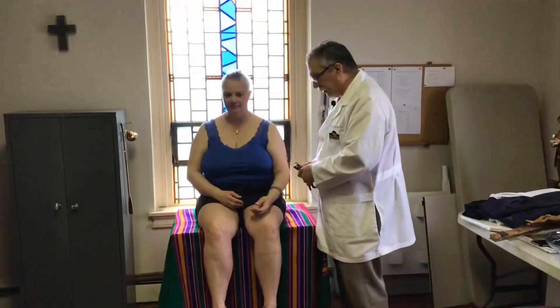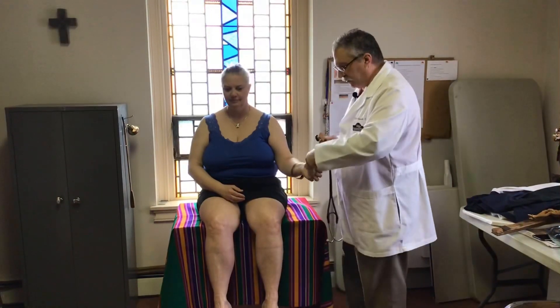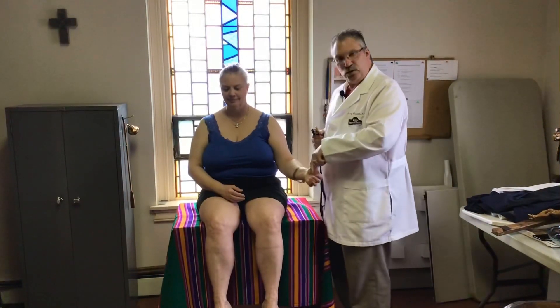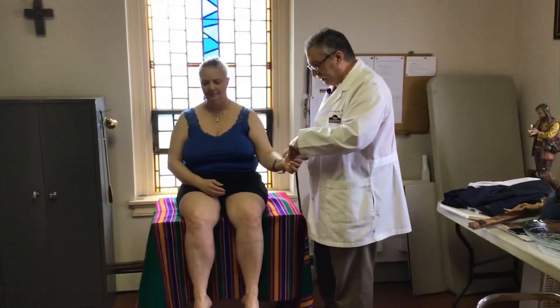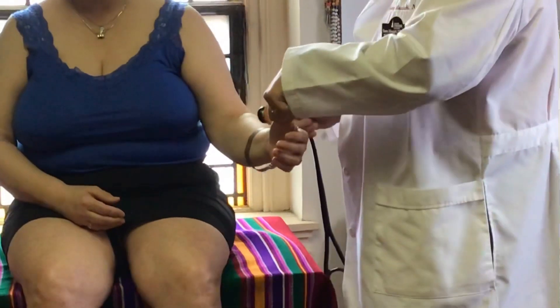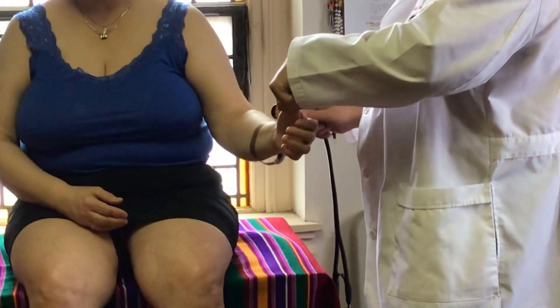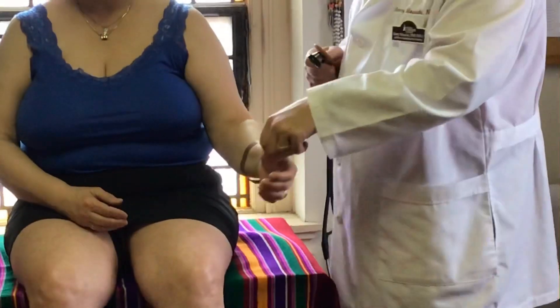The other way is to have the patient relax and hold their thumb, then go to the same landmark and look for those fingers to move. There you go — there's a response.